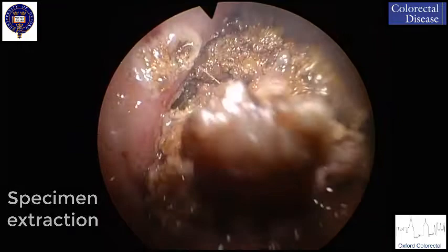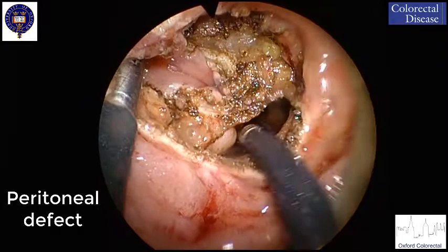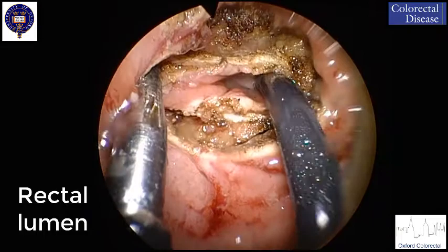After dividing the last strands of tissue, the tumor could be resected in toto. The excision cavity was checked for hemostasis before the peritoneal defect was thoroughly examined to ensure no intra-abdominal trauma had occurred. Next, the lumen of the proximal rectum was clearly identified.